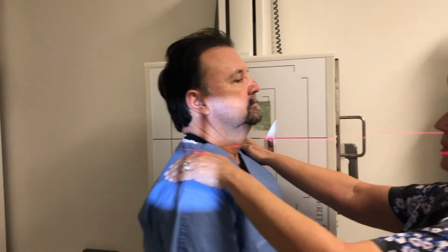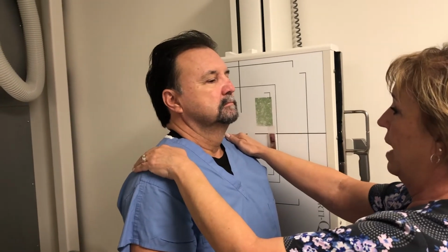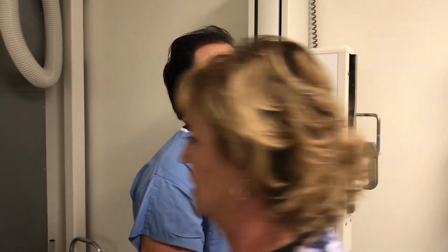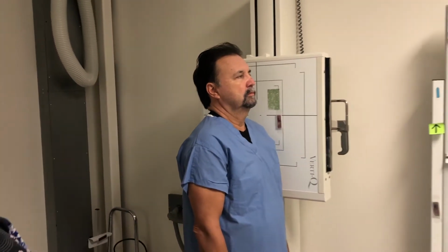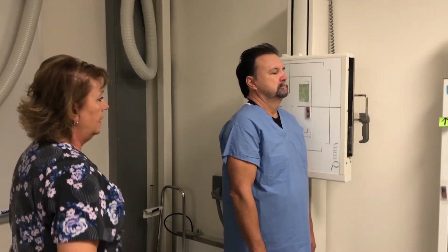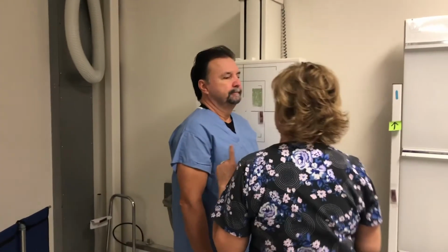I'm going to have you take a breath in, blow it all the way out, hold it out, and I would expose. I'd have a shield in front of him, and that is our lateral cervical spine. Okay. If I looked at this image and I did not see the C7-T1 junction, I would do a swimmer's view. There's a few different ways to do this.